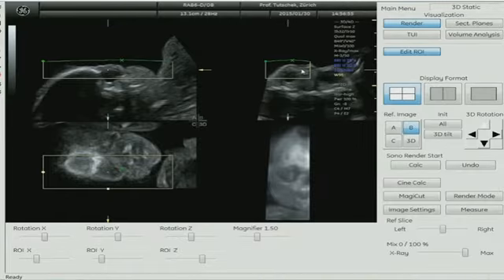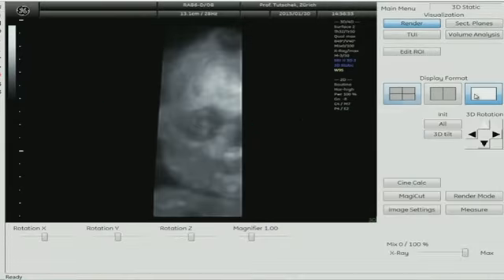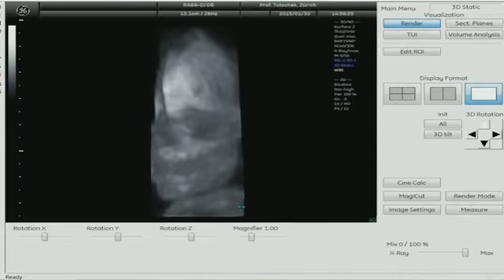Behind the vitreous body, there is an increase in the echogenicity. This is not bone, this is the dorsal increase behind the vitreous body, behind the eyeball. So try to keep this out of the picture. Now, lock the region, magnify the 3D, and now turn this guy on the side.